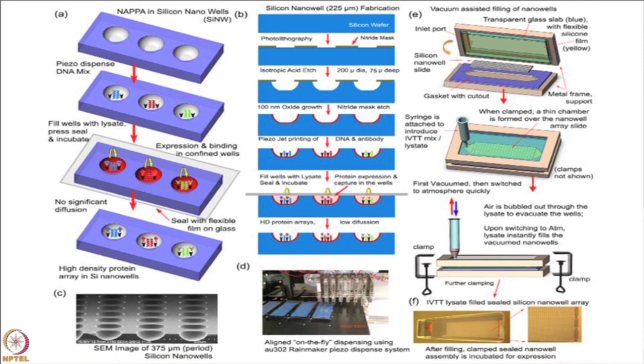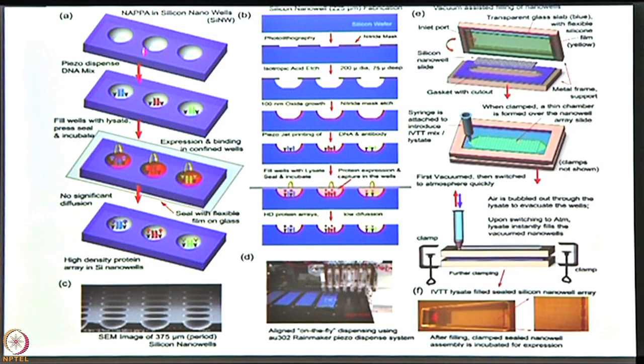What we do is we take silicon, the same material that you use to make computer chips, and we use the same technical approach that they use, what's called photolithography, whereby shining light on the surface, you create a mask, and then you etch it with chemical compounds that etch away the surface, and you essentially can wear away the surface of the silicon. And you end up, what we do is we create these little, what we call nanowells.